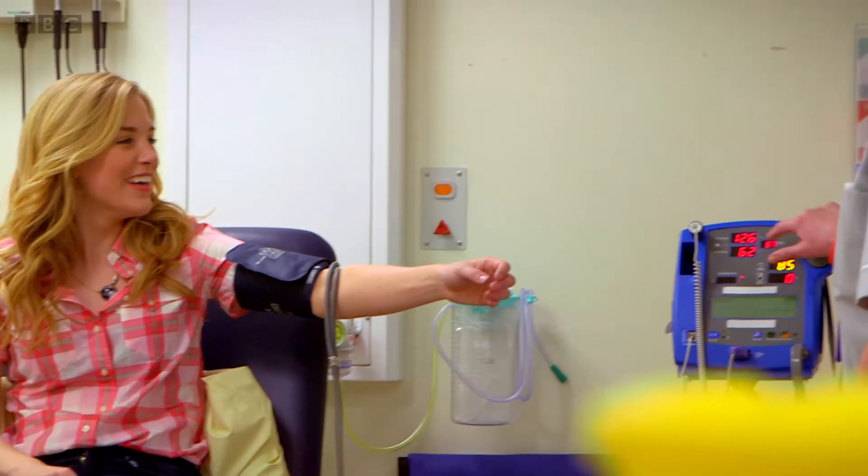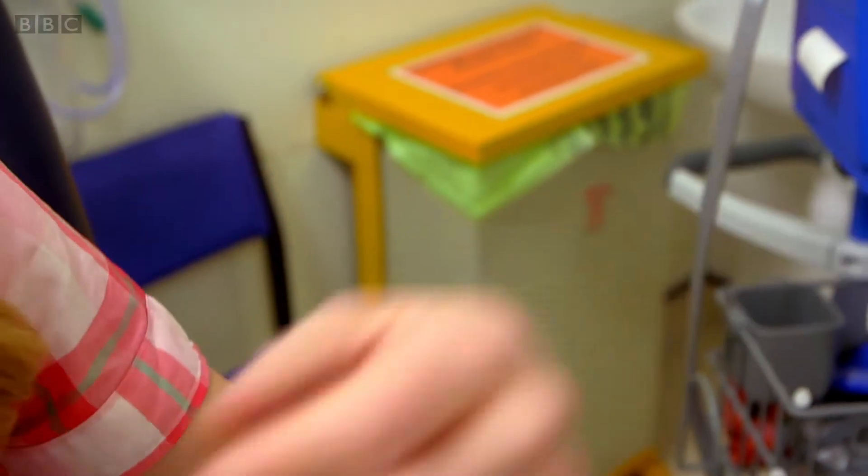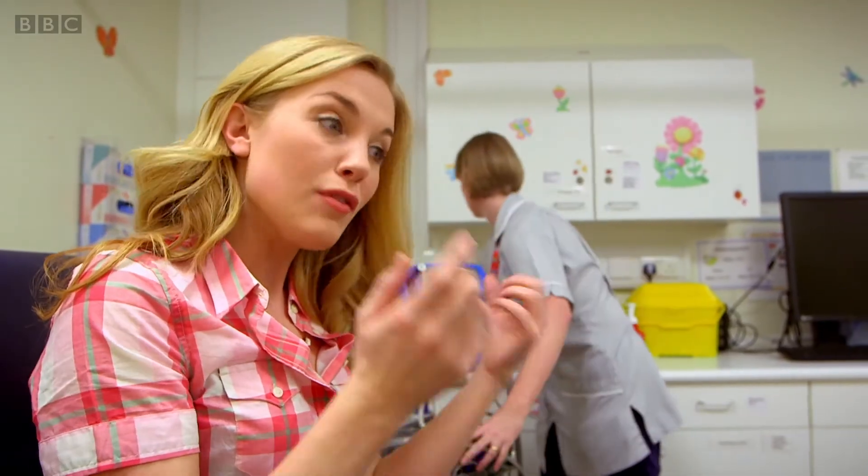Amanda, how's my blood pressure? It's fine today, Maddie. Thank you. So my blood pressure is nice and healthy. But how does the cuff tightening around my arm tell the machine and Amanda that my blood pressure is okay?